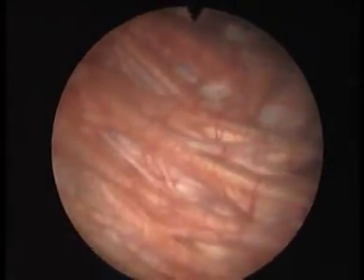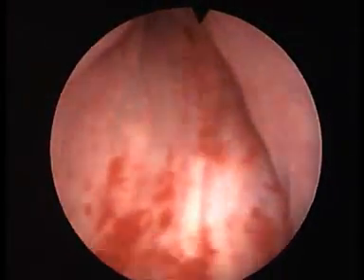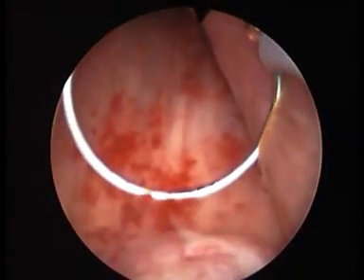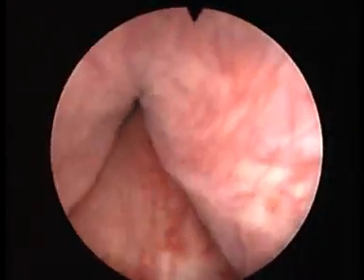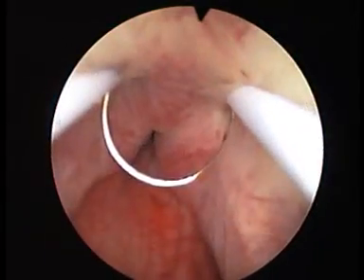The procedure itself is performed using a metal loop which is connected to one side of a diathermy machine. This uses electrocautery to cut through the prostate a slice at a time. We move round the clock taking one chip at a time until there's a nice cavity which allows the urine to pass freely.